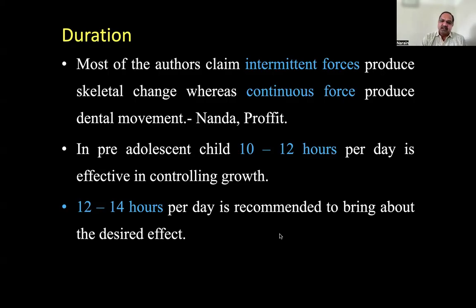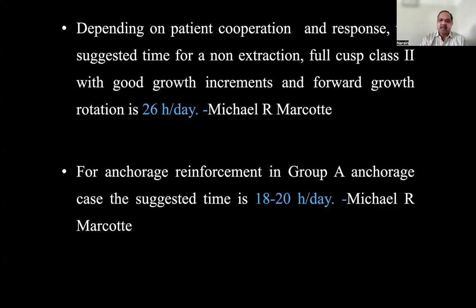Other authors suggest that 12 to 14 hours per day is sufficient to bring about even skeletal effects. But Marcotte is one of the authors who suggest 26 hours per day. So 26 hours means 2 hours more than a day. That is just to emphasize how long a patient should be strictly wearing the headgear.